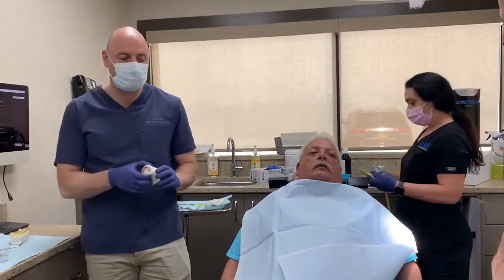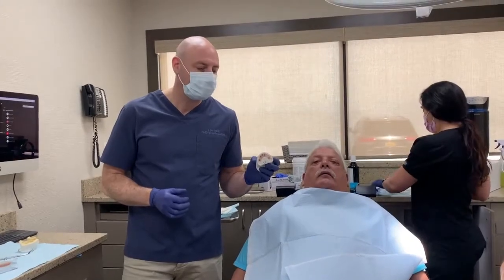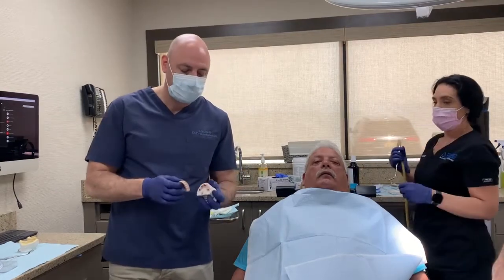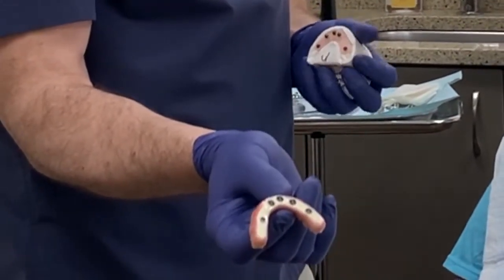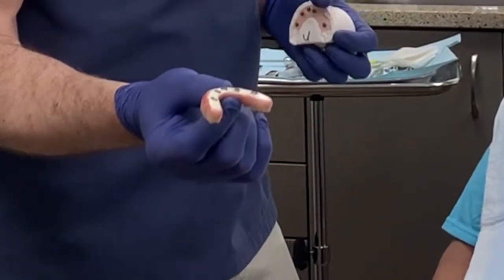Again, everything is made off of the impression that we made after the implants had integrated. His existing provisional has sculpted the tissue, and as you can see, the intaglio of this prosthesis is very hygienic and easy for the patient to clean.